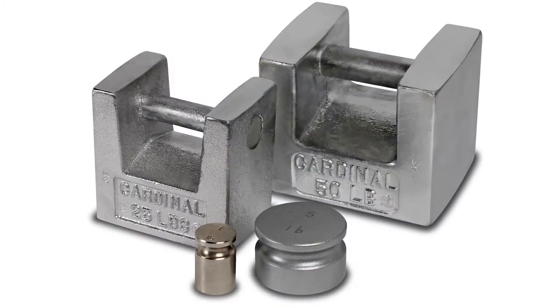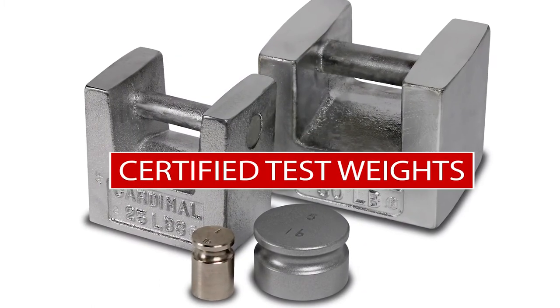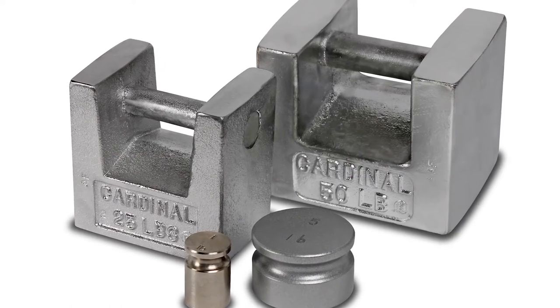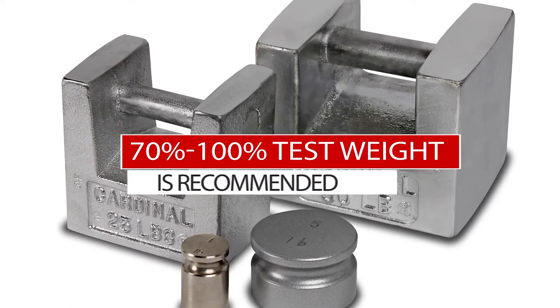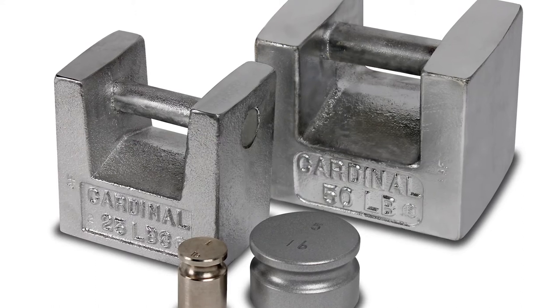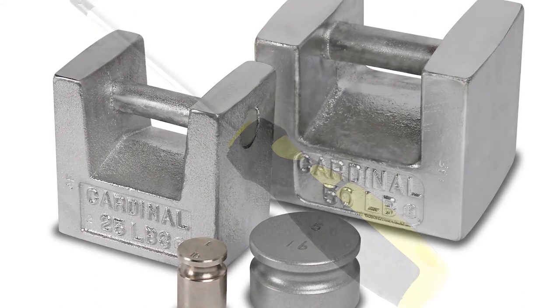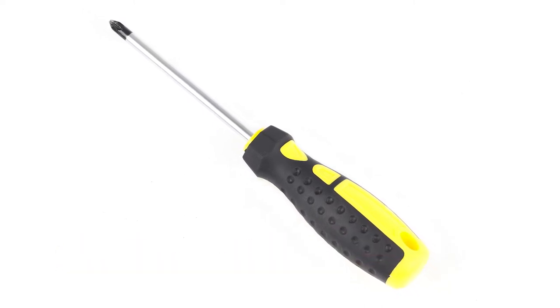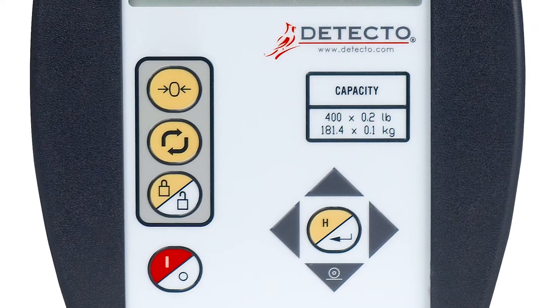To perform the calibration, you will need certified test weights — a minimum of 50% of the scale's capacity, with 70% to 100% recommended — in pounds or kilograms depending on the weighing units selected, and a Phillips screwdriver to remove the side cover to gain access to the calibration switch.